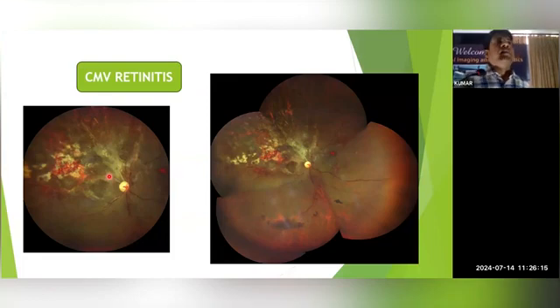So if they have only ocular lesions, we try to manage the initial 1 month with intravitreal injections, weekly twice followed by weekly once. These pictures, when you have them in front of you, give a better understanding and follow-up of the patients. From the previous visit, if you compare the image, you can see whether new lesions have appeared or not, and if the lesions reduced in size or not. And also during follow-up, you can see if there is retinal thinning and future breaks or anything. So all these are very important in management.